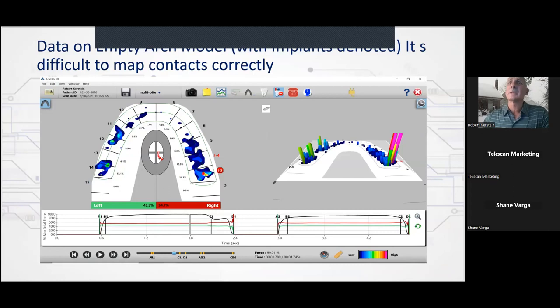So this is typically what we see, is that clinicians will not fill in the dental arch. Now here it's my file. I've filled in my implants on the right side, but I haven't taken out my third molars. I haven't closed my arch for premolars missing that I had when I was a kid. I had 5 and 12 extracted.